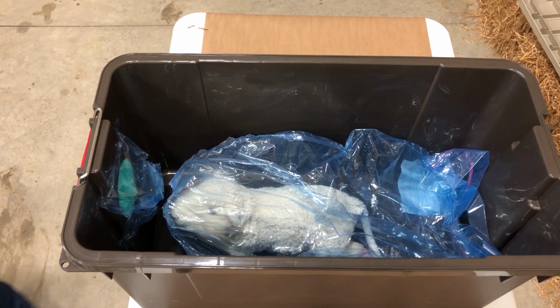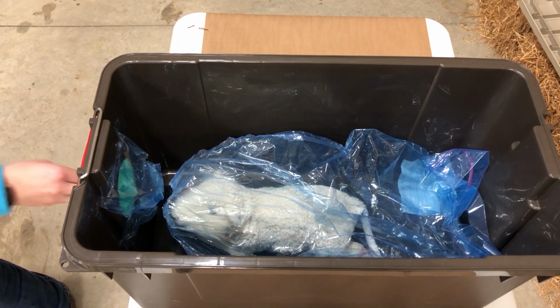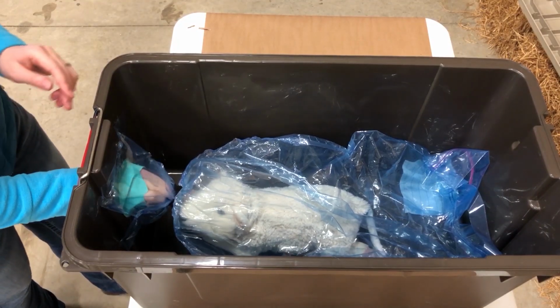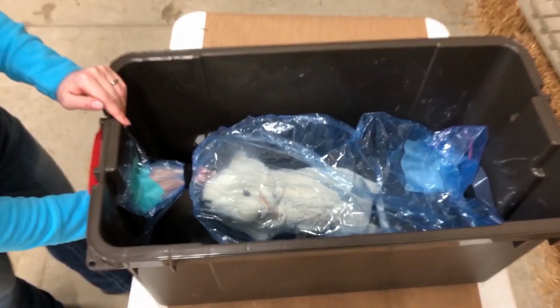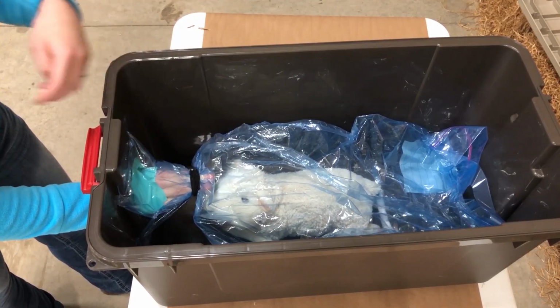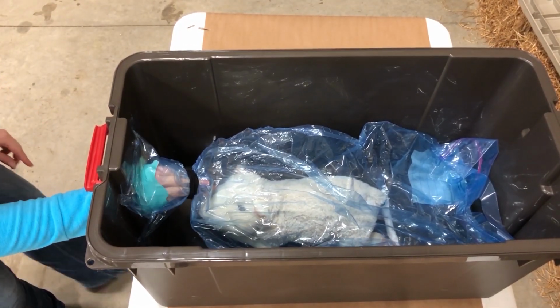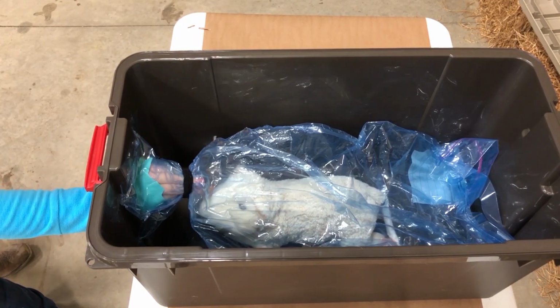So like I said, ring womb would present with just a water bag hanging out and no actual pushing of the ewe. As you can see in here, we have a replica of what her cervix would be. You can probably see that my fingers can barely get through this cervix. It's so tight. There's no way a lamb's gonna come through here.